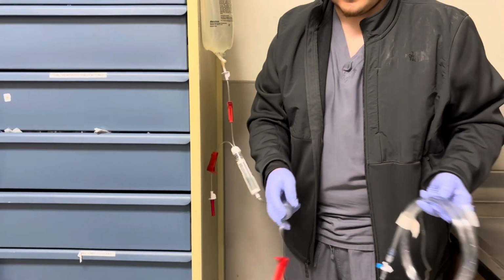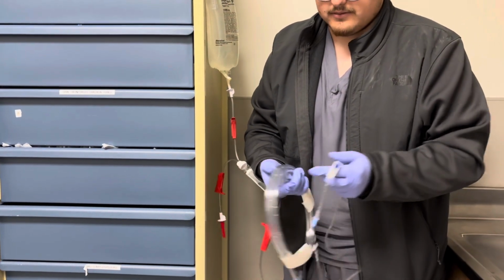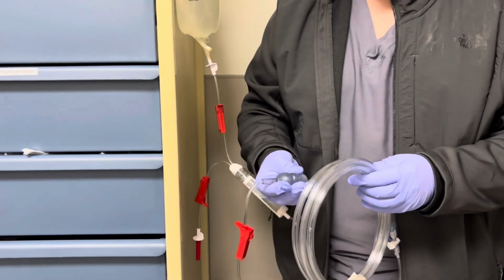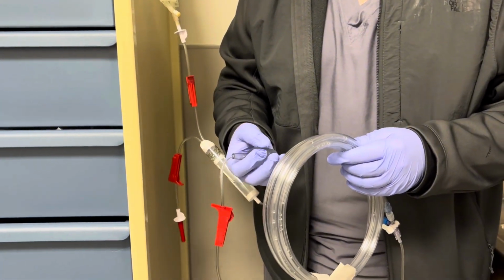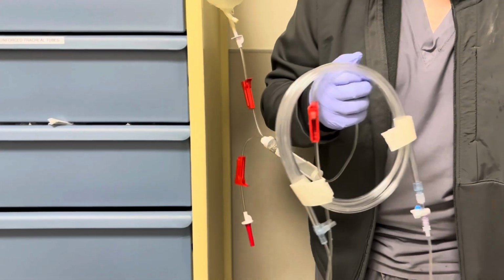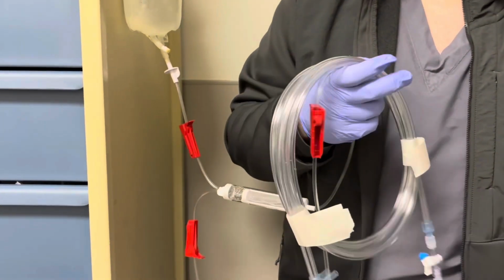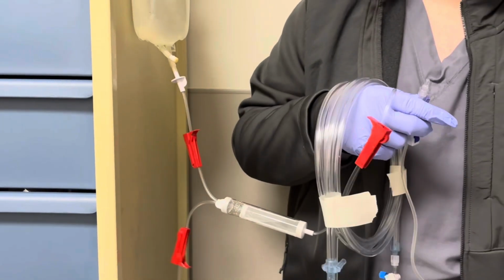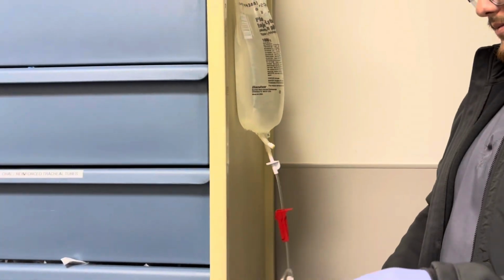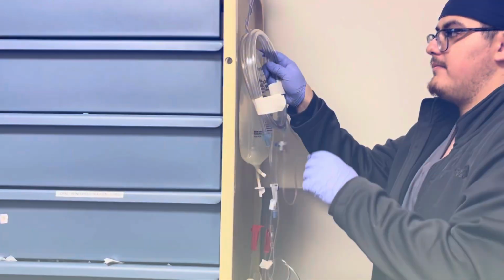Okay, once that's filled up, we're going to prime the rest of the line. You can just do that by giving some more pumps. All the line's priming. Don't see any air bubbles, you can go ahead and close it off. Recap it. And then it's ready to go.